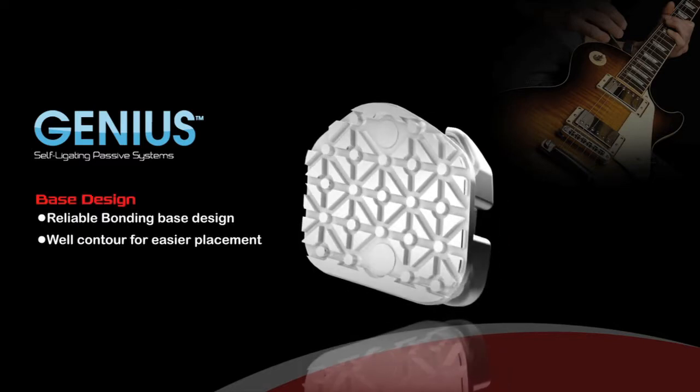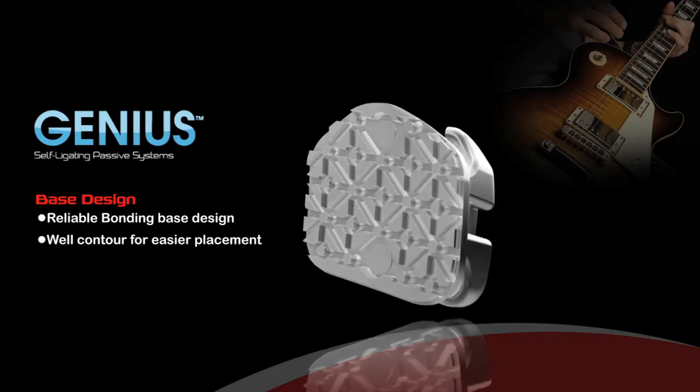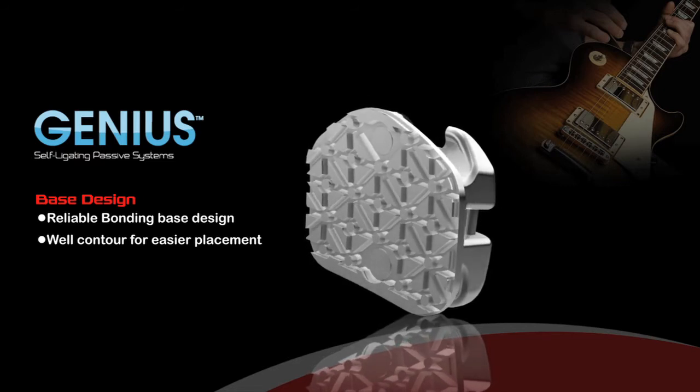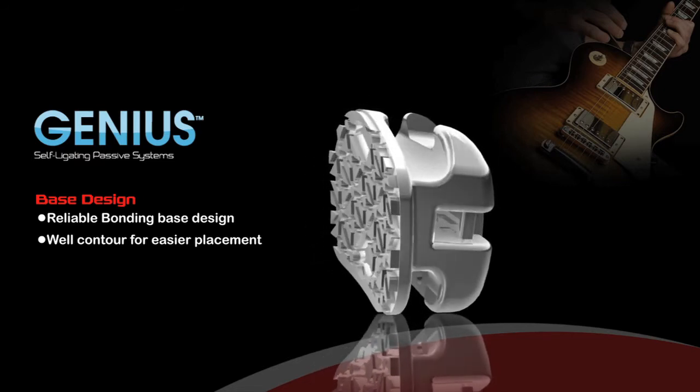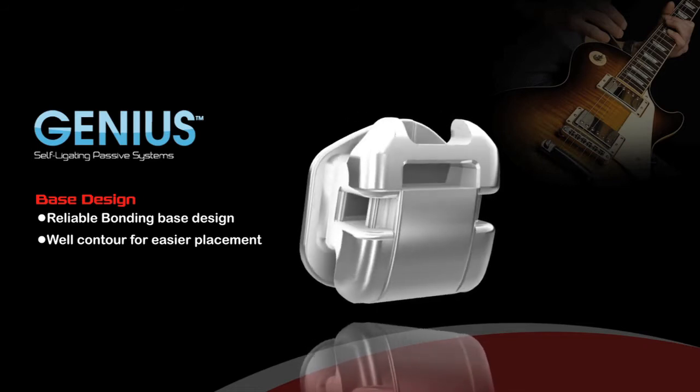Base Design: Genius offers a unique maze-based design that provides consistently strong bonds to prevent bonding failure. The base contour is designed with excellent contouring in the mesial-distal and occlusal-gingival direction for easier and more efficient placement and bonding.